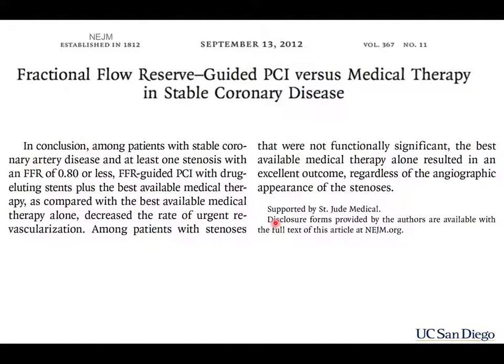Yeah? On average, how big is the catheter lead relative to the diameter of the vessel? That's a great question. So the question is, if the pressure catheter itself has a significant diameter with respect to the remaining diameter after that lesion has done its business in the vessel, doesn't that perturb the measurement as well? And sure, yeah, it does.